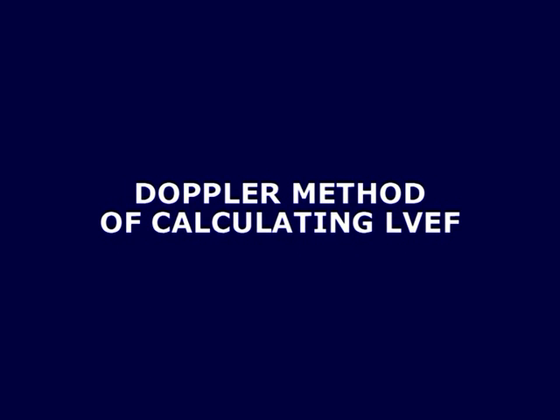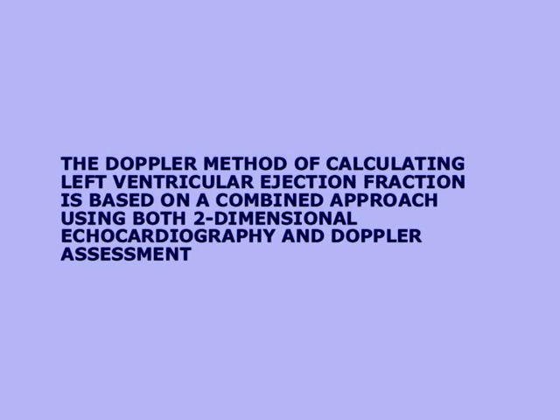Doppler method of calculating left ventricular ejection fraction. The Doppler method of calculating left ventricular ejection fraction is a combined approach using two-dimensional echocardiography for calculating left ventricular end diastolic volume and a Doppler for calculating left ventricular stroke volume.